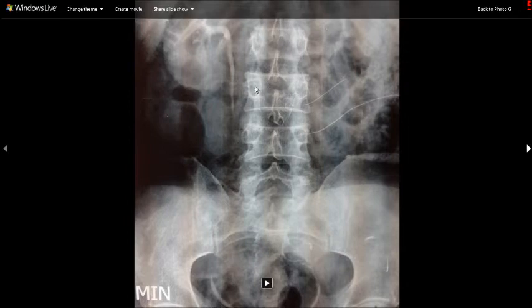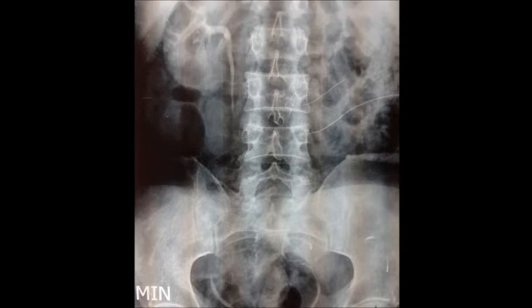Hello friends, this is Dr. Vinod, and today I am going to show you an IVP of a patient where you can see an ectopic kidney.